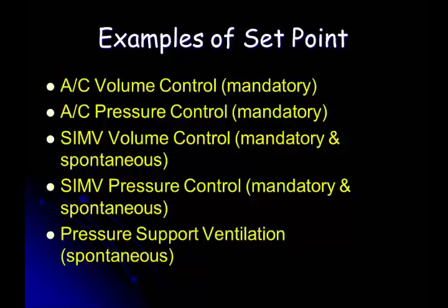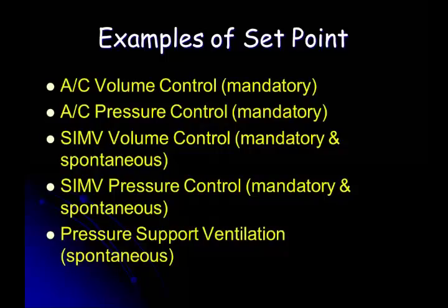Or even if the patient's controlled. All machine. In the case of volume control, it's a fixed volume that we're attaining. That's our target. If it's pressure control, it's a fixed pressure and inspiratory time.